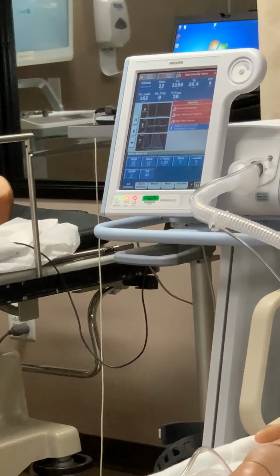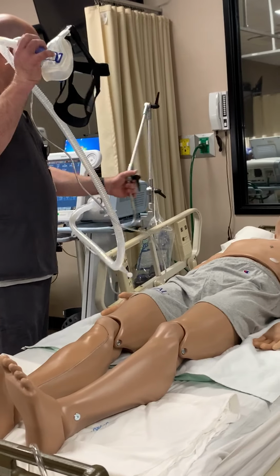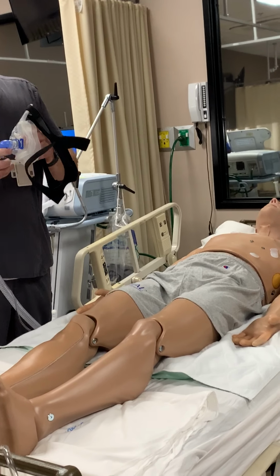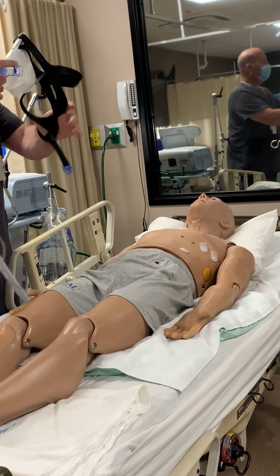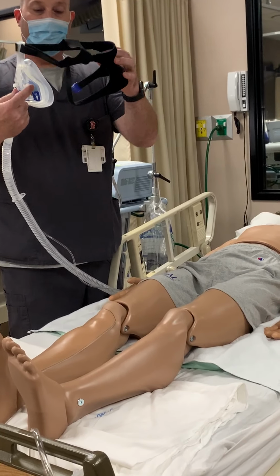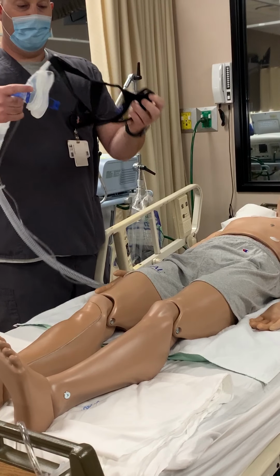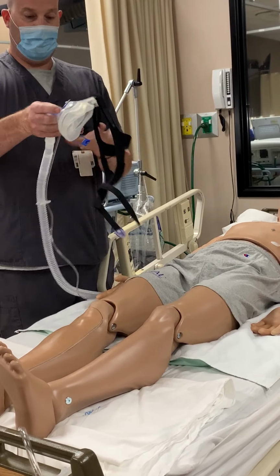Okay. All right, so let's put it on him. Okay, so what I like to do, and he's a little hard to do this with because he's got a big head and it's plastic, so it doesn't slide on there as easily as it does over here, but I like to get 3 of my points of contact in place so that I'm only having to fool around with 1, okay?